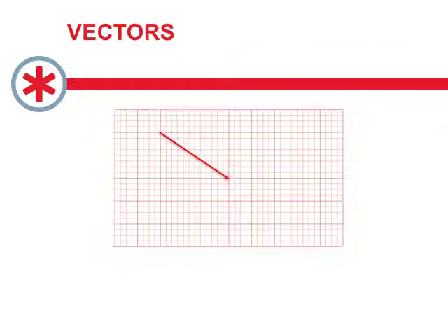And so I am really likely going to butcher this concept a little bit, but the way to think about a vector is that basically a vector is a thing that can be described as the sum of its parts. I know, really deep. So if we look at the electrical current that we're describing, say, from ventricular depolarization, depicted here, we can break it into its two component parts. And the easiest way for us to do it is describe basically how far it runs from its left to right direction and how far it runs in its up and down direction, otherwise known as your X and Y axes.